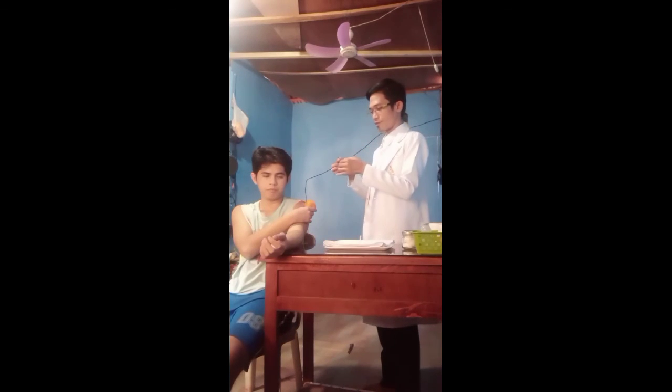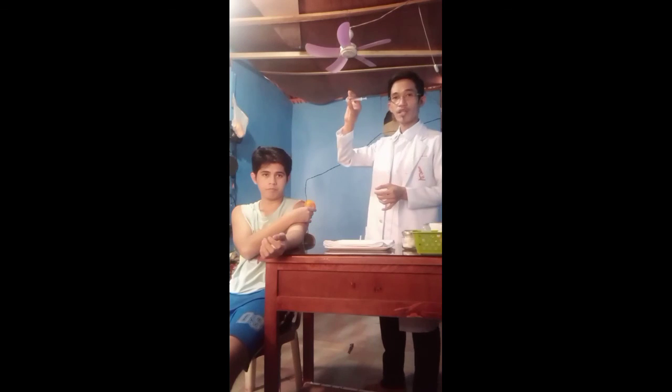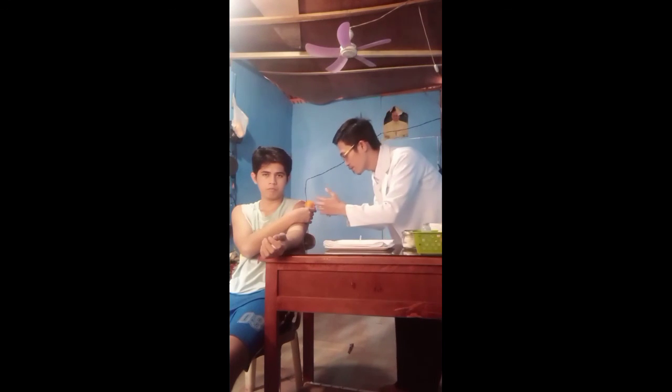Remove the cap first, and then inject at 90 degrees in the dart position, just like this. Inject it slowly.